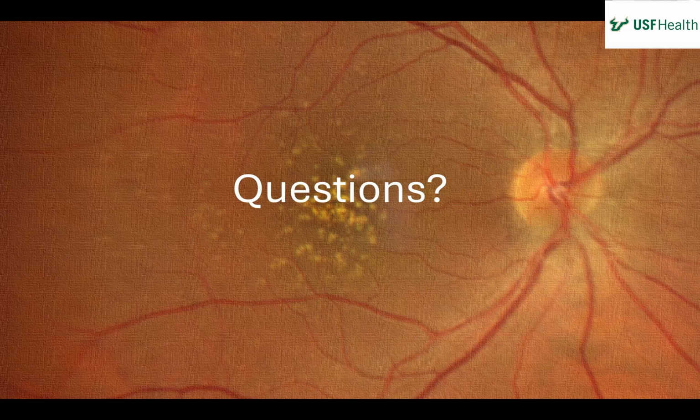This is so weird because this is age 54, so probably in her 40s she started, and you'll see that. You'll see some people with a lot of drusen. Now, 80 to 90% of people have a druse, so it's very common to see a druse somewhere in the fundus. That's why I had one in my 40s when I first came here. I thought I would be blind by 50. So drusen are very common. That's why it's nice to keep in your head that it's not all macular degeneration.